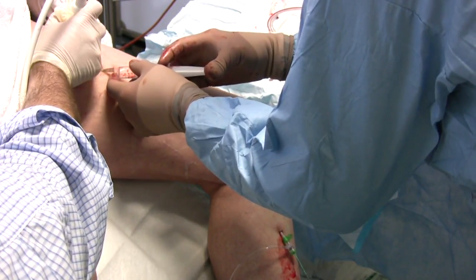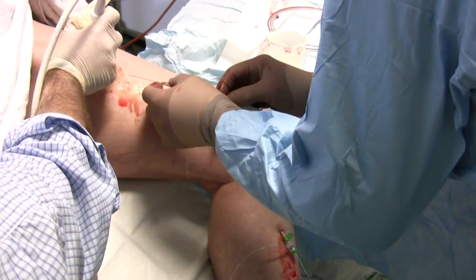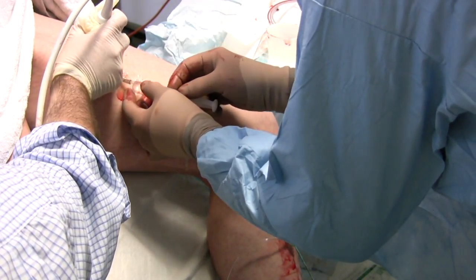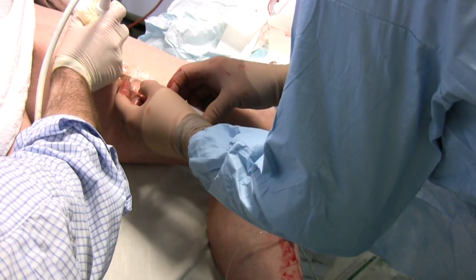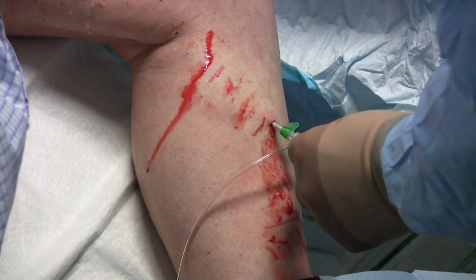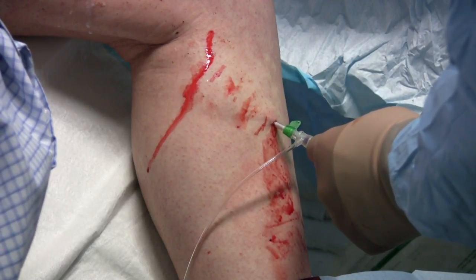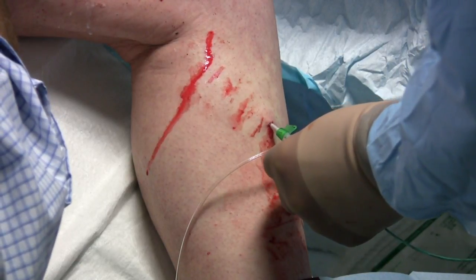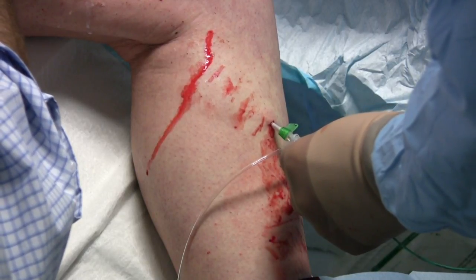Once again, local anesthetic is introduced along the course of the catheter to protect both the adjacent nerves and to make the procedure painless, as the heat from the laser would otherwise be quite uncomfortable. Once again, the laser fibre is withdrawn slowly down the vein, the correct amount of energy being delivered to the vein by viewing the ultrasound image at the same time. This enables accurate obliteration of the appropriate vessel.